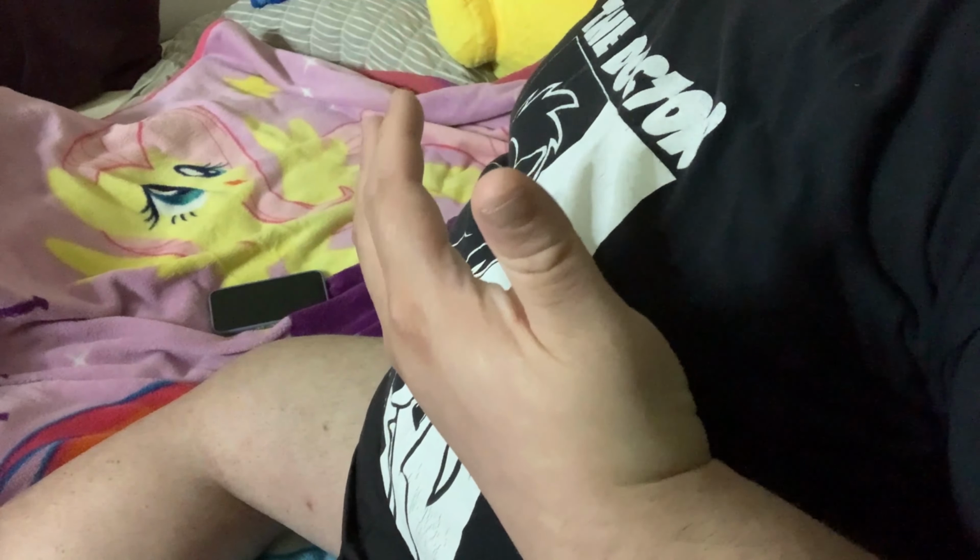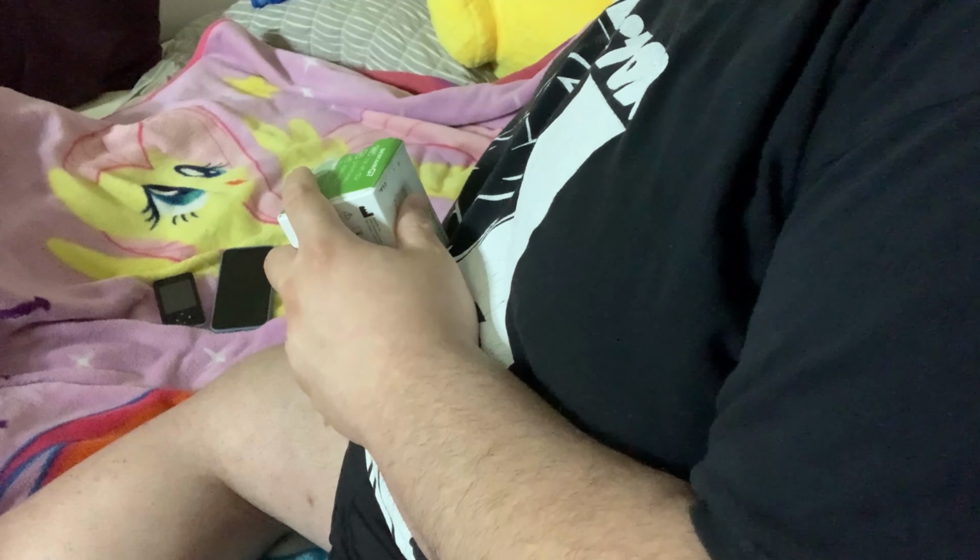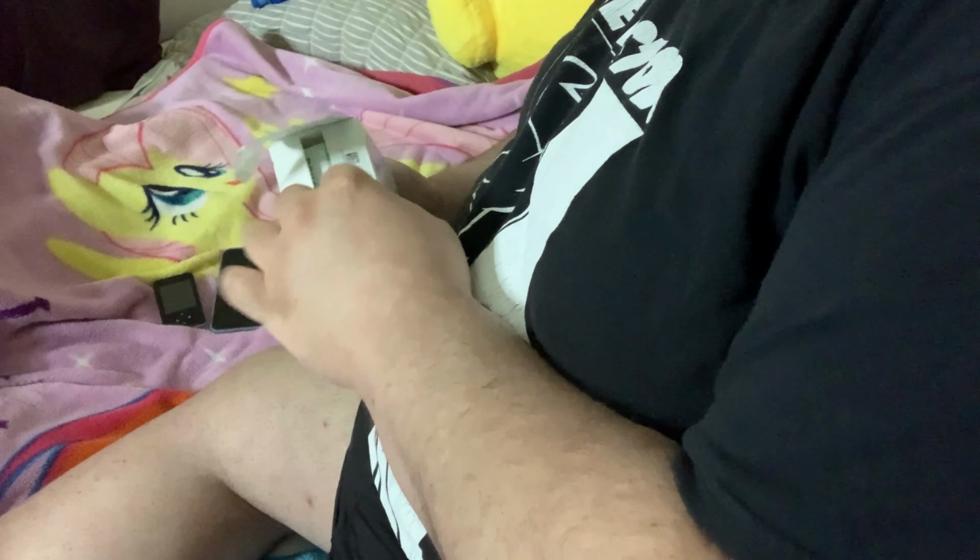I'm going to go ahead and open up, and you guys will see all the process on how to put your sensor on your skin. If you're type 2 like me, and of course, it's a demonstration. You guys notice I changed my shirt. That's why I took a shower early, for a reason, because I don't want to be stinking. Of course, I don't want my skin to be all dirty for this process, like I said before. So without further ado, let's get started. Okay, let's open up this box. You get the patch and the little stabber.